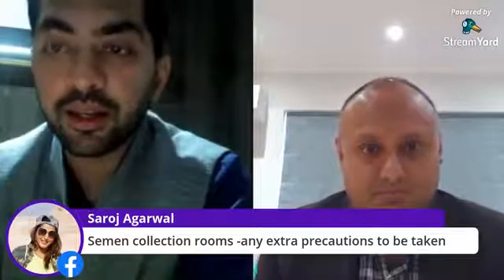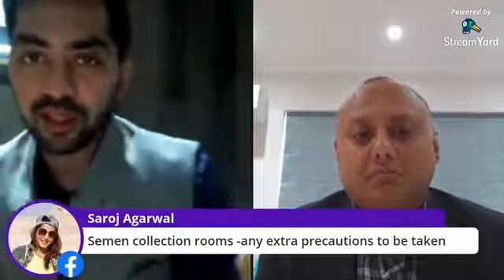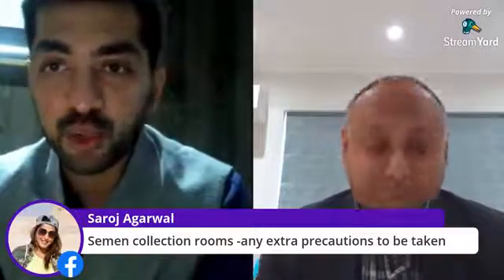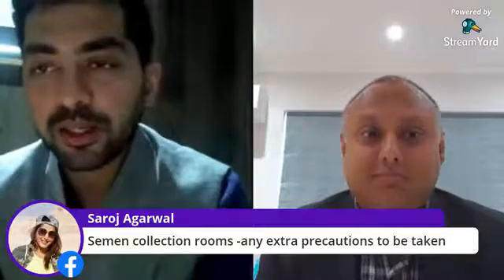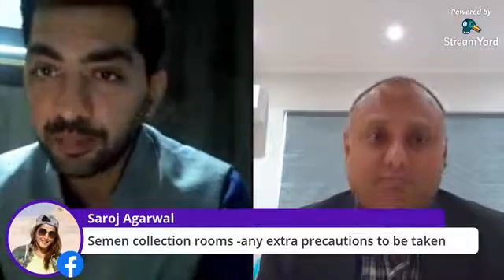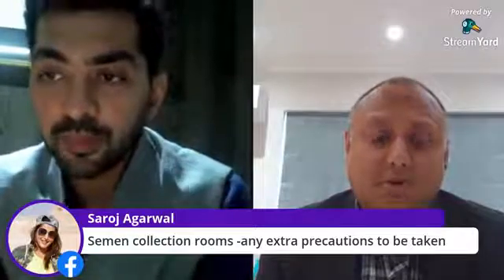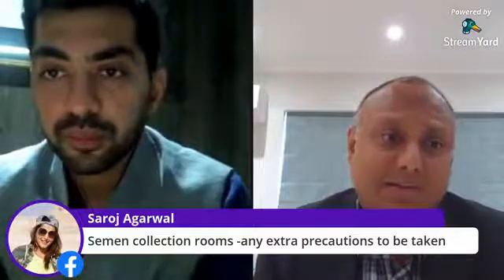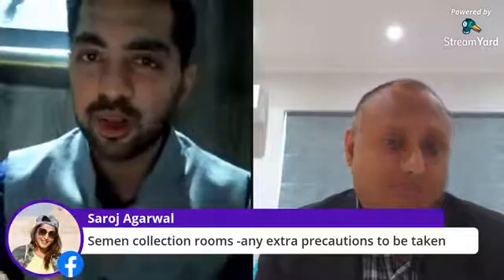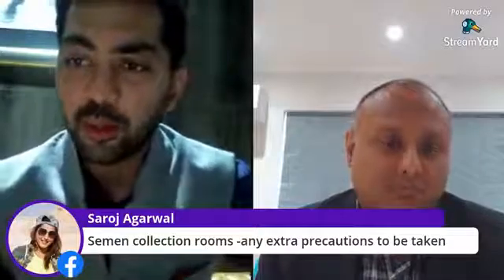Okay, so that's good. But again, I'm not sure how well this approach will work in India, because we're really worried about the identity of the sample in our scenario, and there are issues with that. So maybe with proper consents, we can also think of it and then just decontaminate the container properly and then use the sample, or something like that could be offered in India as well once we begin. Otherwise, as you said, Keshav, freezing the sample is not a bad option. It's just one extra step. It's not expensive, so that's also something that can be thought of for patients here.